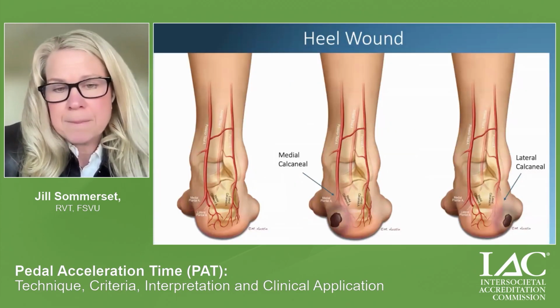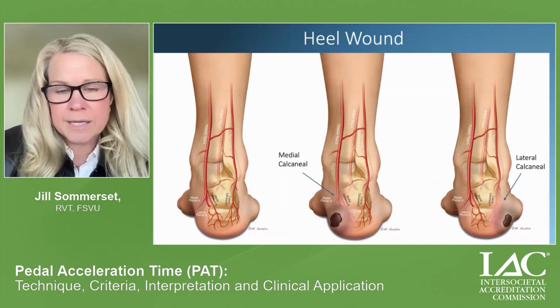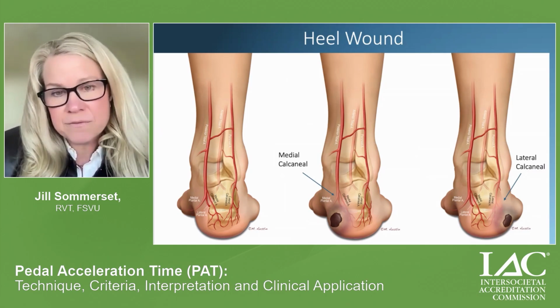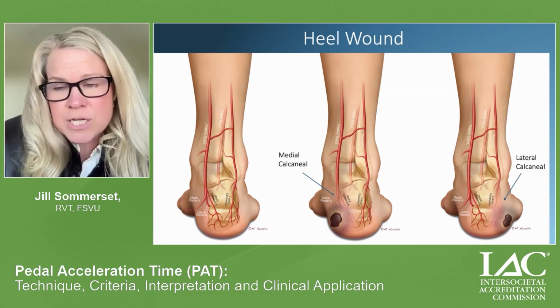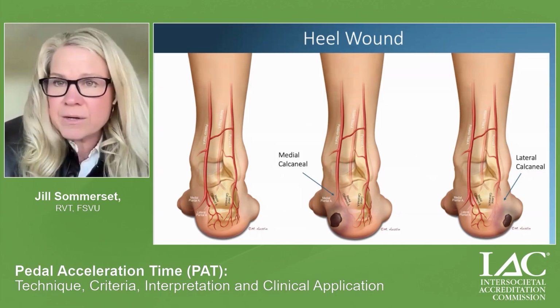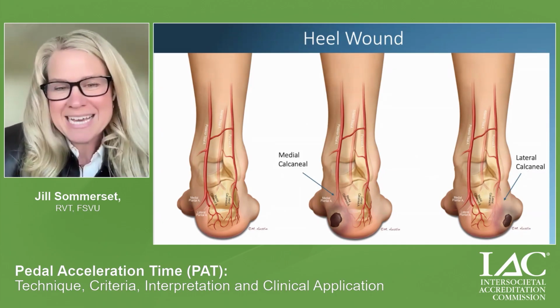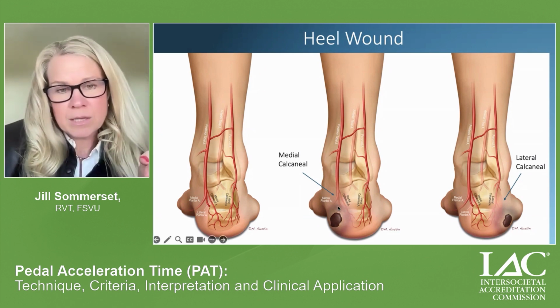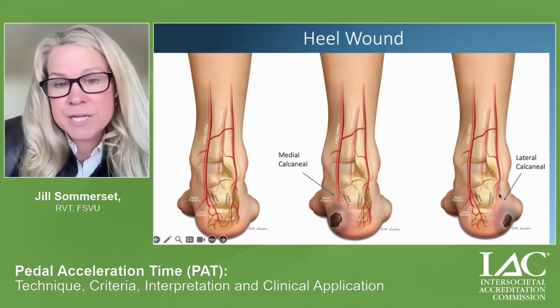I do want to mention heel wounds. Dr. Tesso and myself and colleagues are working on heel wound research because we have found very good results in evaluating the medial and lateral calcaneal branch using PAT because it can be a very challenging wound bed to evaluate. So the medial calcaneal branch is a branch off the posterior tibial artery. The lateral calcaneal branch on the lateral side is off the peroneal artery.